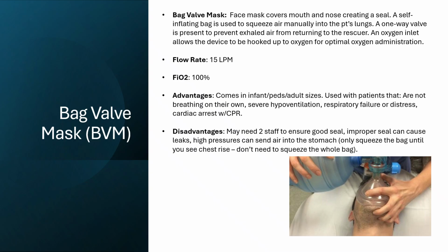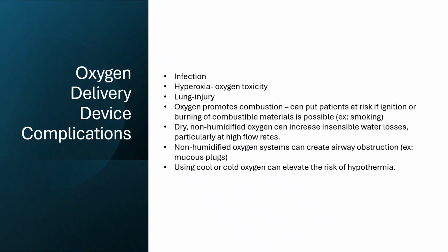And you really only want to squeeze this bag until you see chest rise. You don't squeeze the whole bag by any means. Just squeeze it enough to see chest rise and then let it go. If you put too much air in, you can actually overfill and put air into the stomach, and then your patient will likely vomit on you. So don't do that. So along with oxygen being wonderful, it certainly can cause some complications.